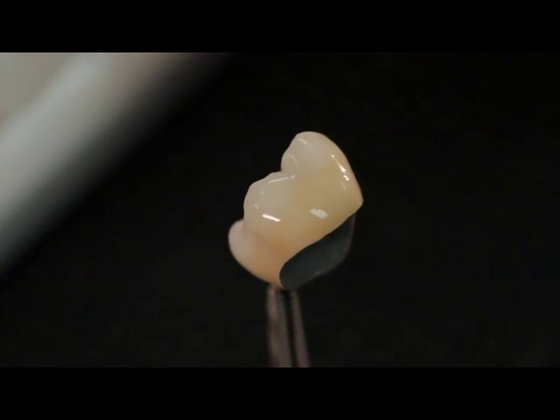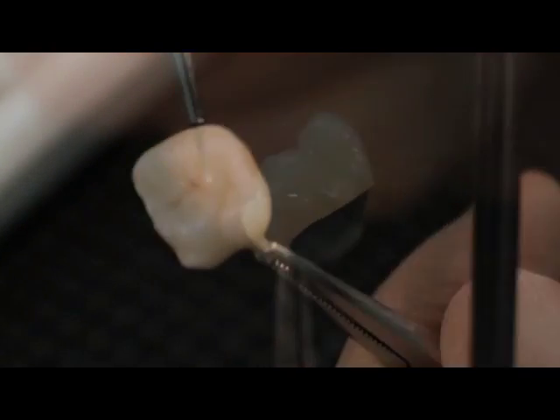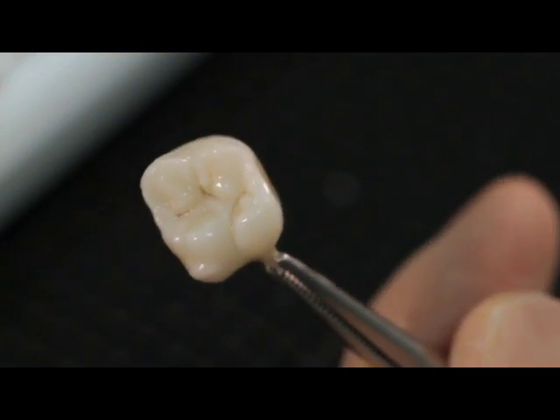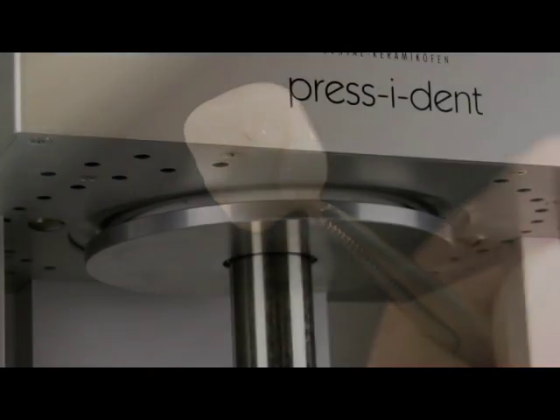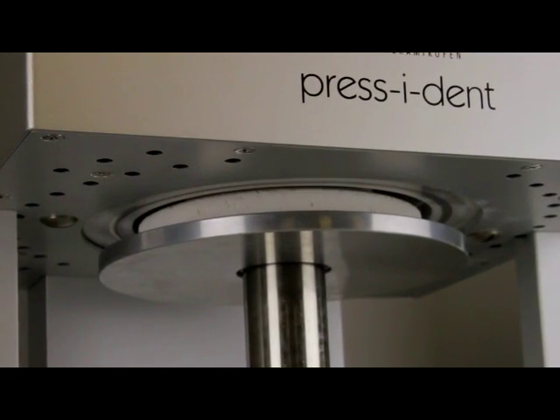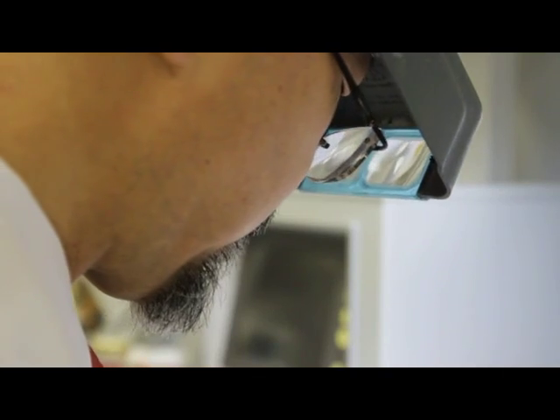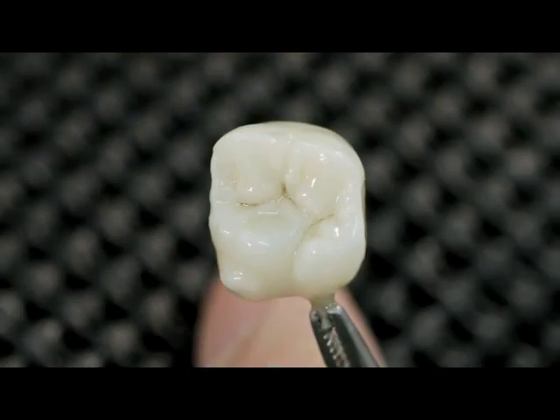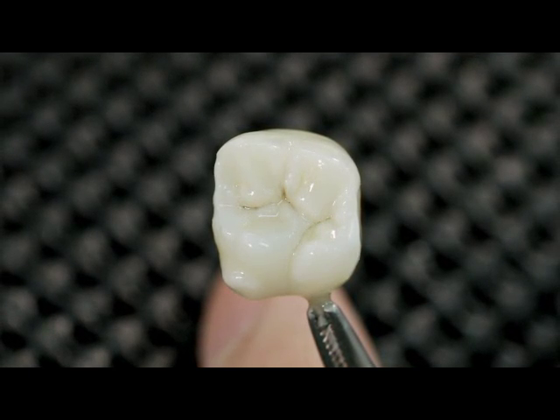The requested surface texture and smoothness of the Lustre Paste layer can be obtained by soft vibrating or condensing the restoration. The firing parameters will depend on what type of ceramic the Lustre Paste are applied to. Please see the Initial IQ Lustre Paste NF manual for more detail. Beautiful result in just one firing.